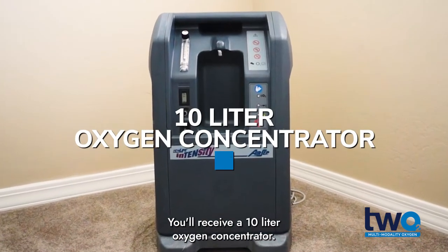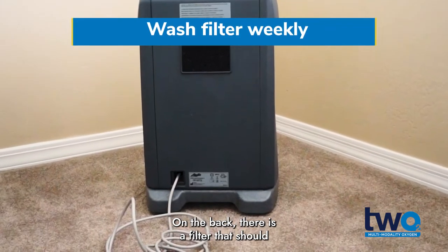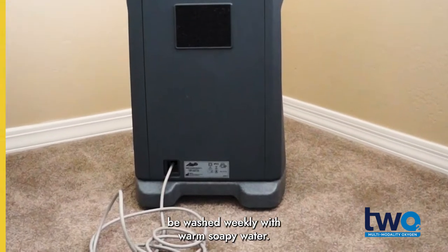You'll receive a 10-litre oxygen concentrator. On the back, there is a filter that should be washed weekly with warm soapy water.